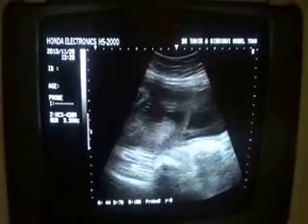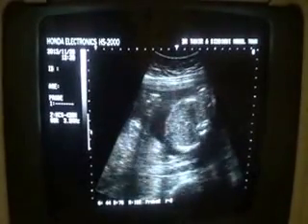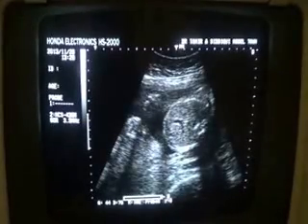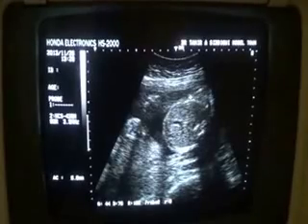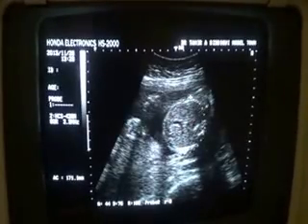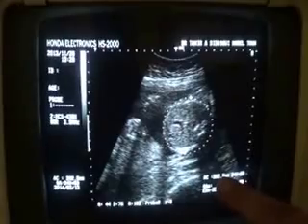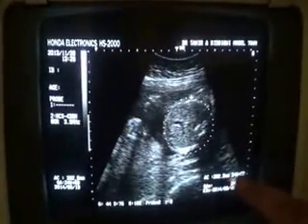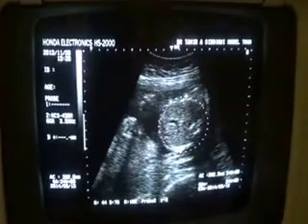Both pregnancies are in separate segments. This is the abdominal circumference of pregnancy number one. The gestational age is 24 weeks 5 days. The abdominal circumference is 202.5 millimeters. This is the vertebra and this is the transverse of the abdominal cavity — it is a 24-week pregnancy.